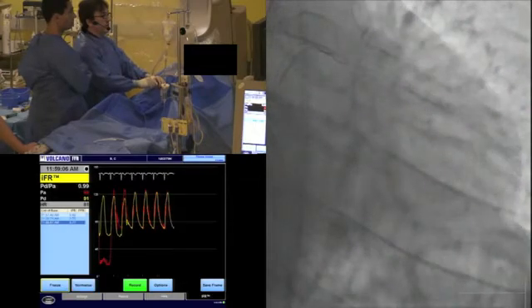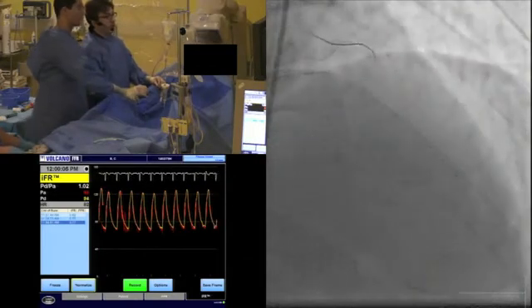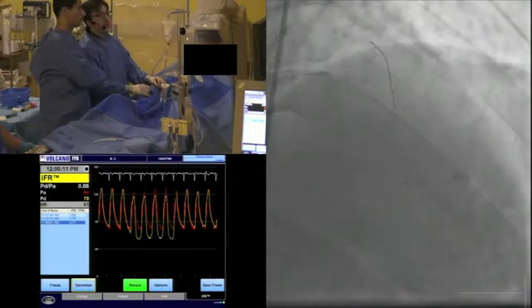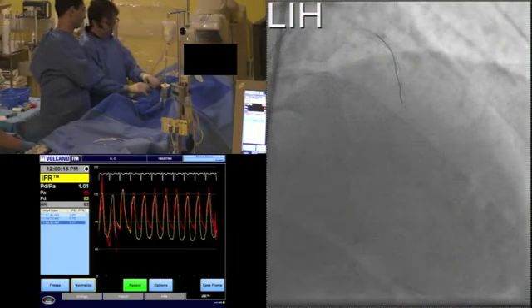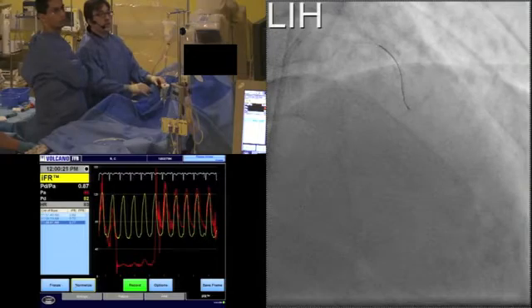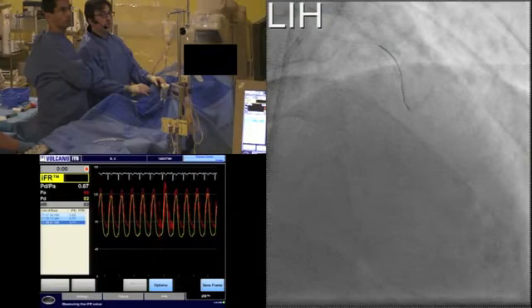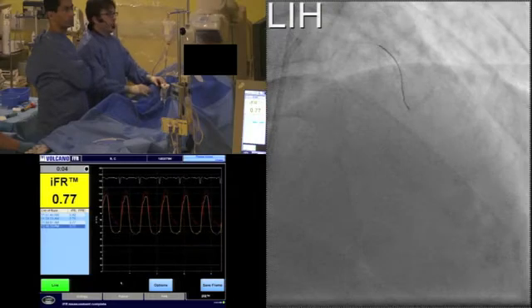So I'm now going to bring the wire back towards the ostium here. I'm just going to change the direction and now point up towards the LAD. So even just across the distal left main stem there, we've got a very, very significant result, I think. Kevin, can we just make a measure there? 0.77, so significant again.